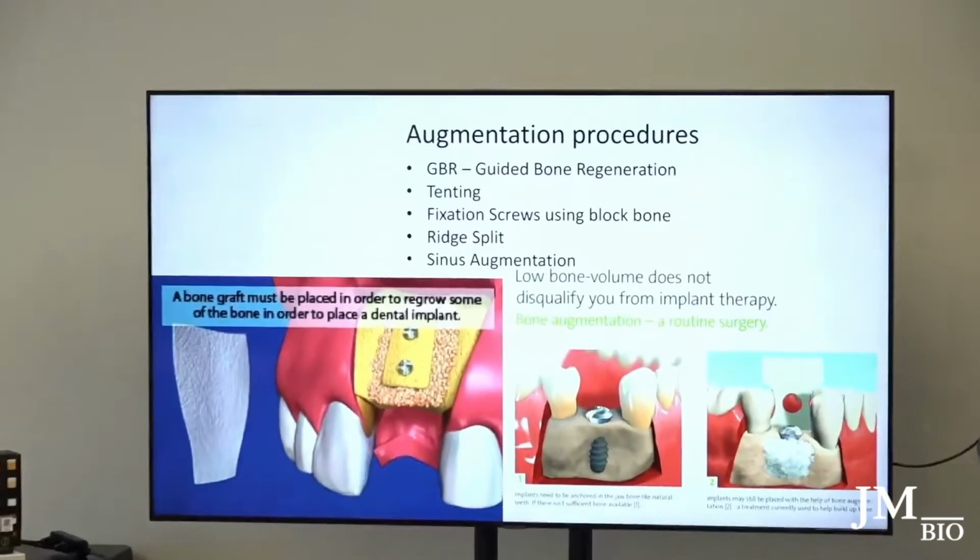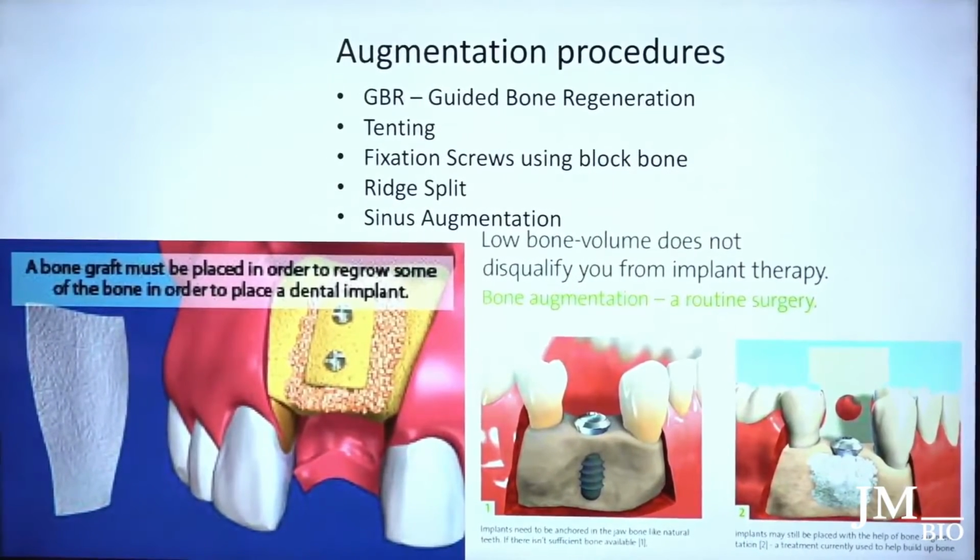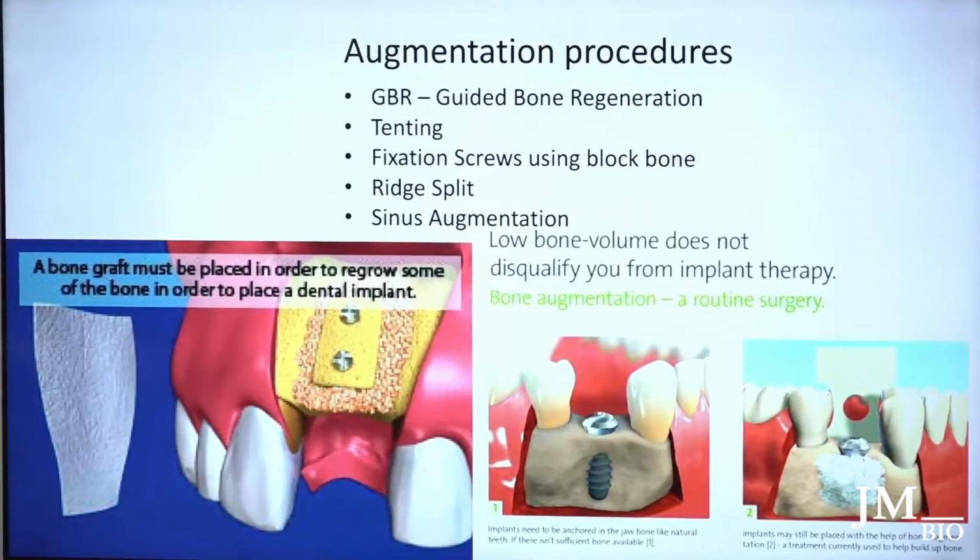You have bone block grafts too. GBR has a bit of a clinical track record now. It's a newer technique, it hasn't been out that long, but it has a pretty decent clinical track record, and it works very well. Knowing how to do good guided bone regeneration is important for success, because if they don't have bone, you have to build it up so that you can place your implants. And even if you're placing the implant and the bone's damaged, we do GBR in conjunction with the implant to build the bone back up at the same time.